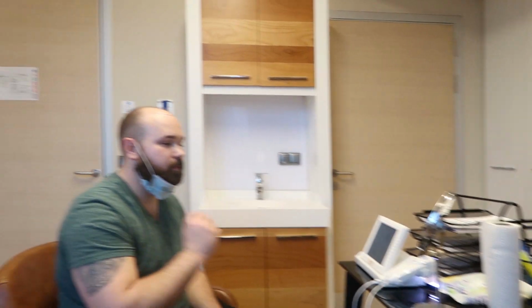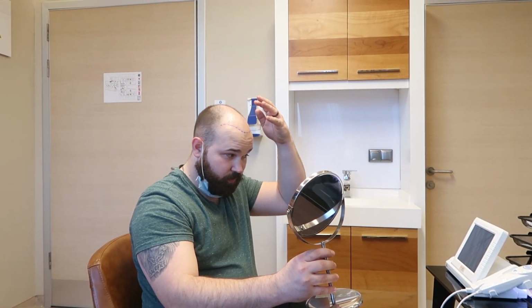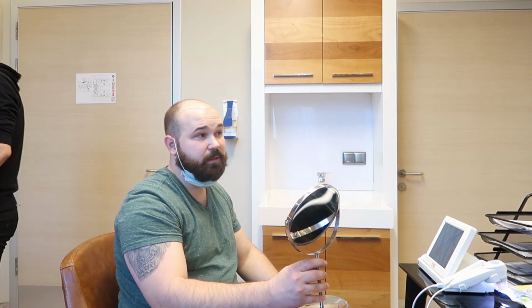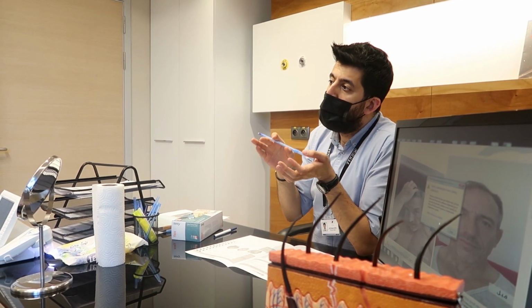So you're saying you just do the front but not the middle? Exactly, because if we spread all the grafts to all the empty areas, the density will be so low, and your operation will be meaningless. So if you take some from here and they grow here, will they look different than the ones you take from here? Actually, we will mix them. The number of grafts that we can harvest from your beard is so small compared with the donor area, so they are not so visible. There is some small difference in the color of the beard right now, but as I said, the amount of grafts is not so huge, so they won't make such a big difference. It doesn't seem weird. Okay.